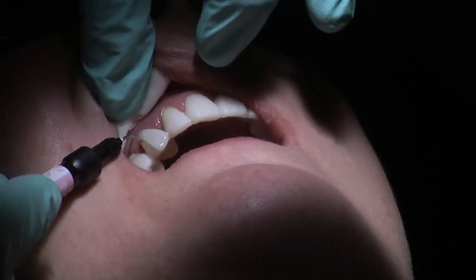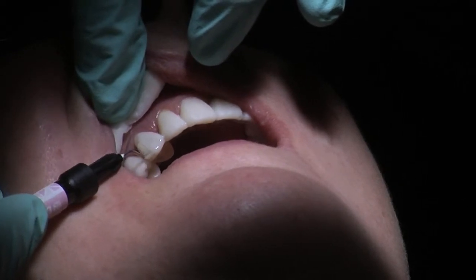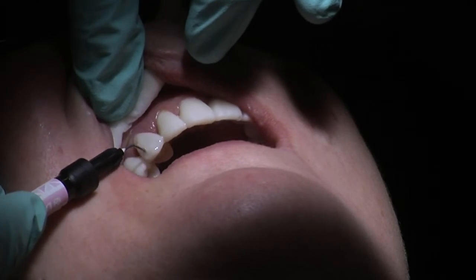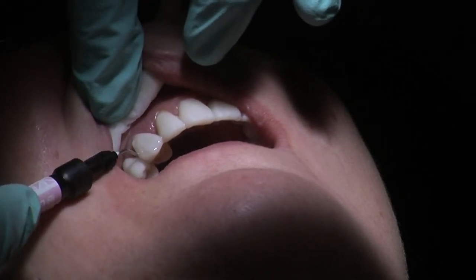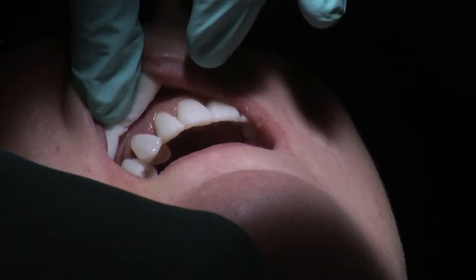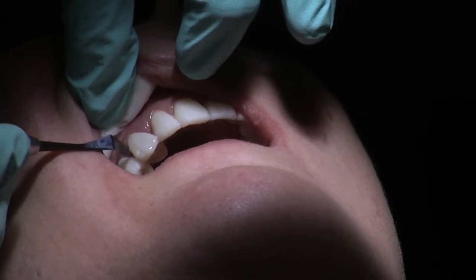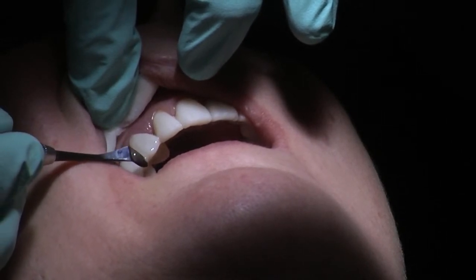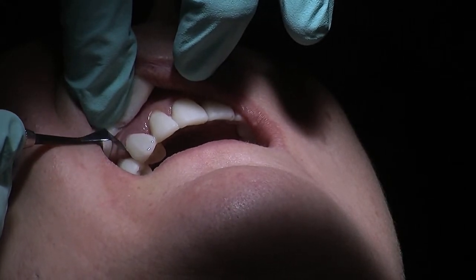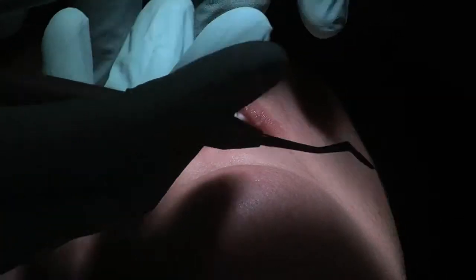So we're going to just build up the distal aspect of this canine now. So once again, I'm just adding the Luxaflow here. Keeping the tip in the material, just letting it flow out slowly. And then this instrument here, the spade, is fantastic. It just very gently manipulating the material into the right position. I like to get as much work done as I can just by playing with the material rather than drilling later. Can the light please?